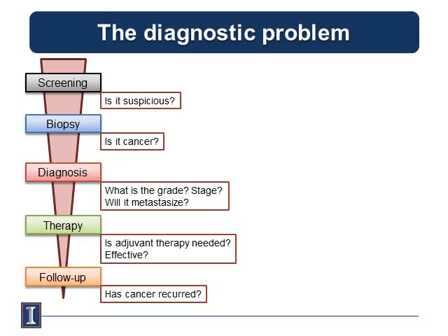So I'll switch gears and tell you about where we're applying these strategies that we've been developing. What we're interested in in my lab is looking at cancerous samples and trying to answer questions at different levels in the healthcare enterprise in the cancer domain. If you think about the cancer diagnosis and staging problem in this country, we take a large number of asymptomatic people and put them through what we call screening. And the only question there is, is there a suspicious lump or not? Is there something that we need to do afterwards?